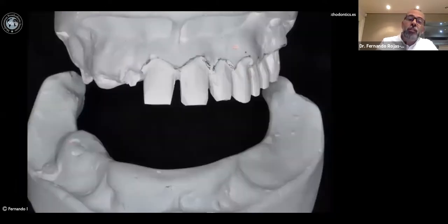I measure from the distal end of the incisive papilla. I removed the slide because we only have 45 minutes, but it was like 15 millimeters, and on average it is 12 and a half. So I moved the teeth anteriorly.